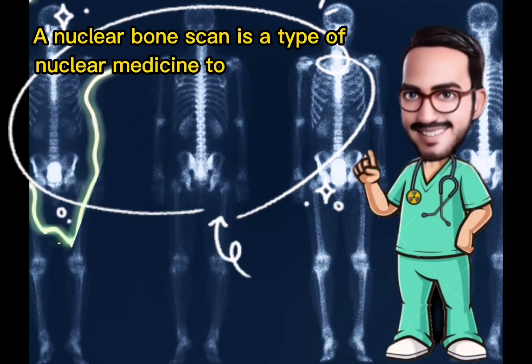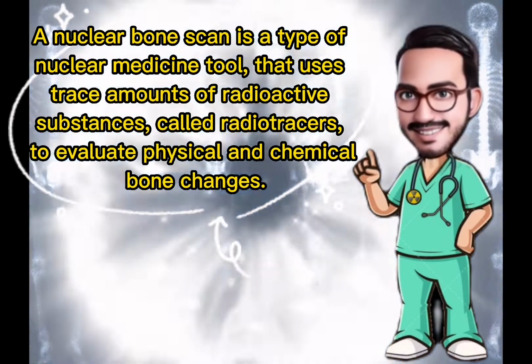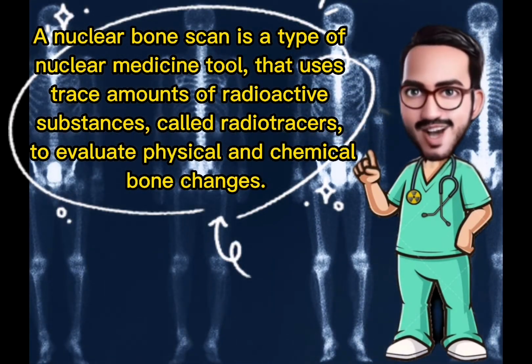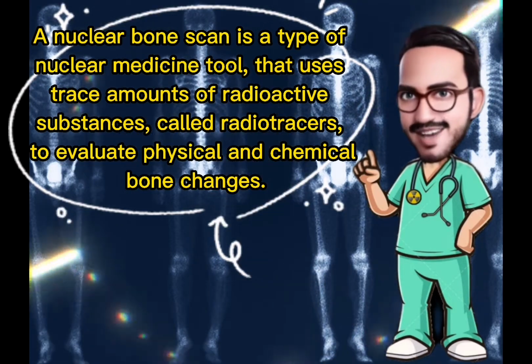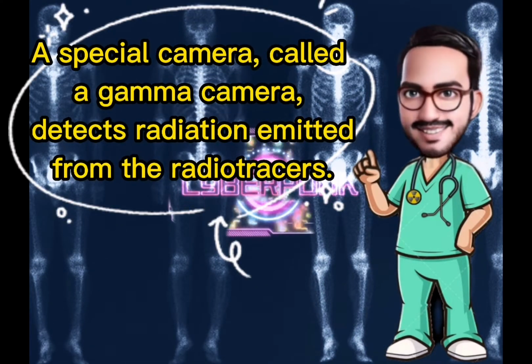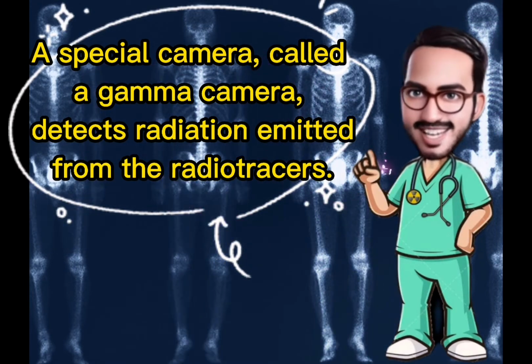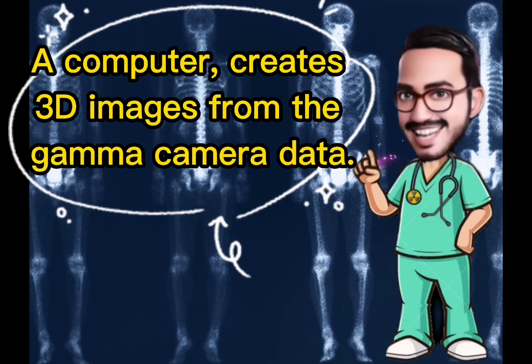A nuclear bone scan is a type of nuclear medicine tool that uses trace amounts of radioactive substances, called radiotracers, to evaluate physical and chemical bone changes. A special camera, called a gamma camera, detects radiation emitted from the radiotracers. A computer creates 3D images from the gamma camera data.